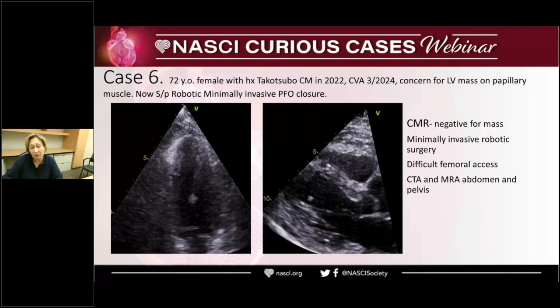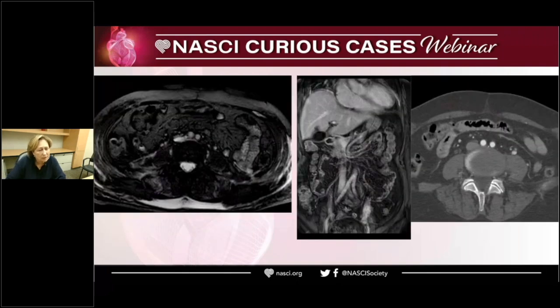So, I want to show you these images. Those are combined. This is CTA that was done prior to the surgery, and this is an MRI that we did after. If someone has this diagnosis, is this May-Thurner syndrome? That is. So this patient had May-Thurner syndrome, and there was really no history of DVT, but again, there's May-Thurner syndrome.